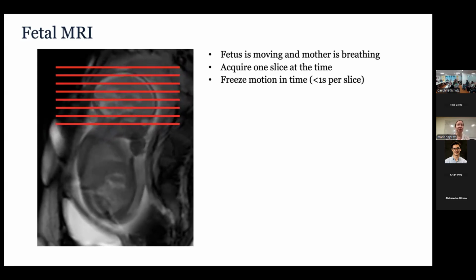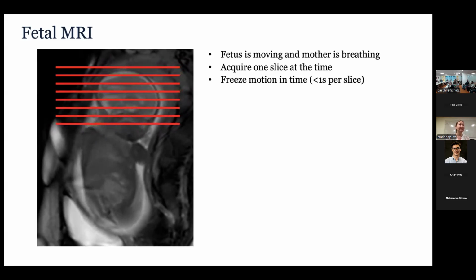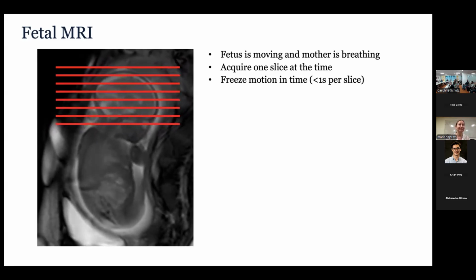That's kind of experience, even though I'm still amazed that it works, because the motion can be on a faster scale than that. From what I know, maternal breathing is 2 to 3 seconds, so we are really pushing when it's 1 second.